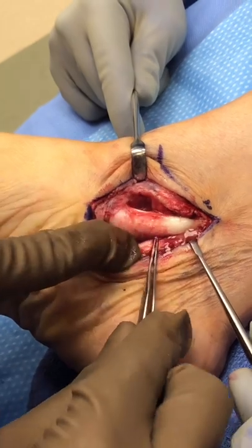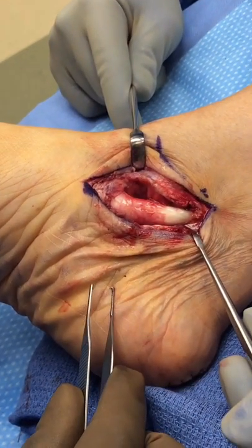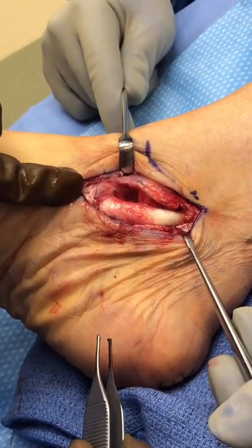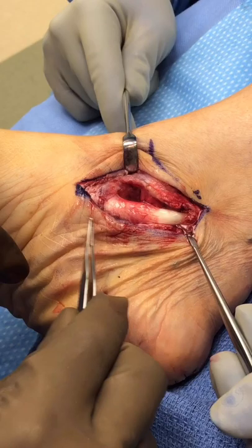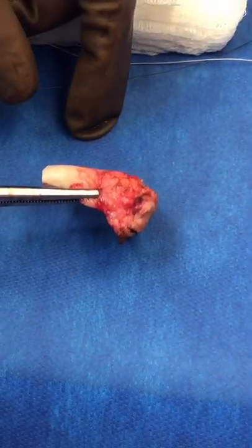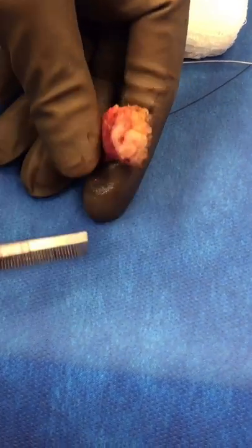We will find the tendon right below it called the flexor digitorum longus, which goes to the little toes, and we'll transfer that to the navicular to essentially take the place of the diseased posterior tibial tendon. Here we've removed the diseased portion of the posterior tibial tendon — you can see how thick it is and what we call chronic tendinosis, with this yellow appearance from the chronic inflammation.